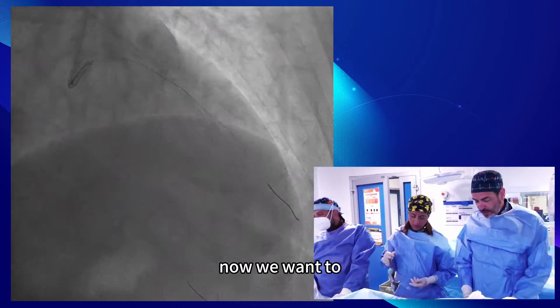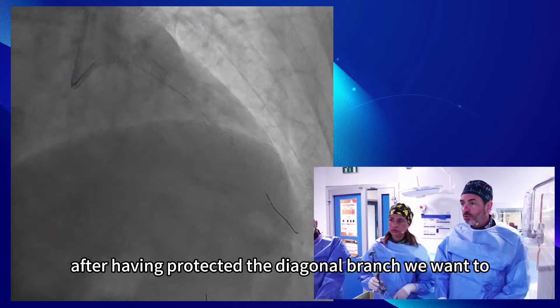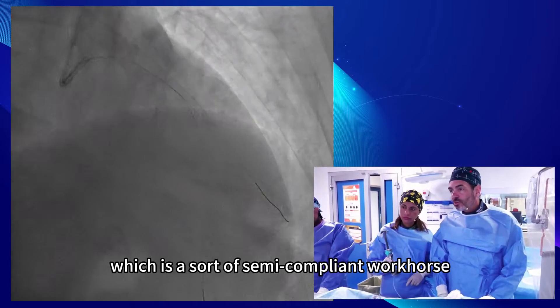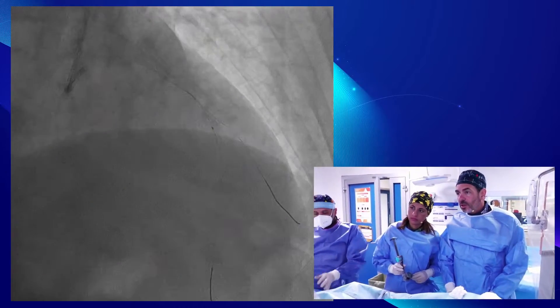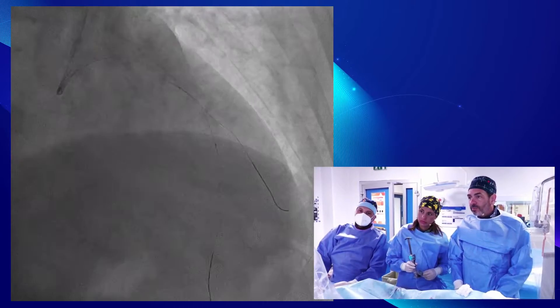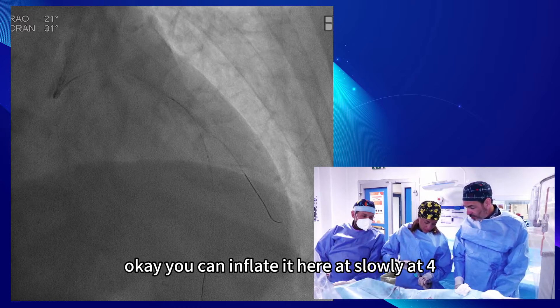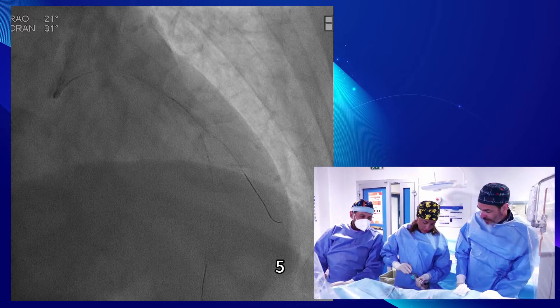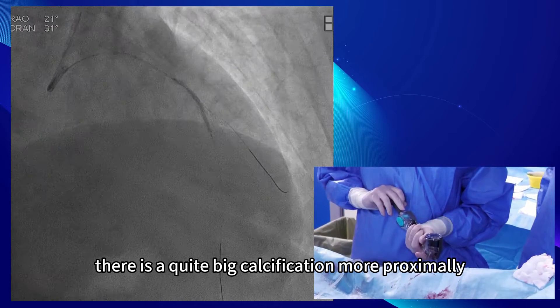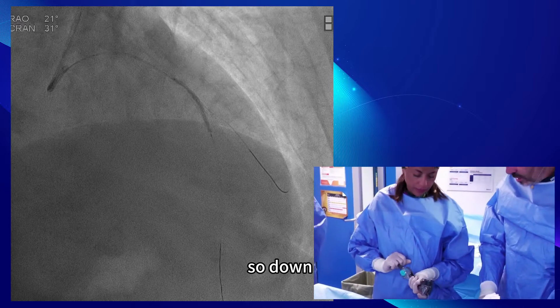After having protected the diagonal branch, we want to increase the size of the balloon. We are using an Artemis, which is a sort of semi-compliant workhorse with pretty nice deliverability. We inflate slowly at 4, 5 atmospheres. There is quite a big calcification more proximally, and the balloon is not well expanded, which is not strange.